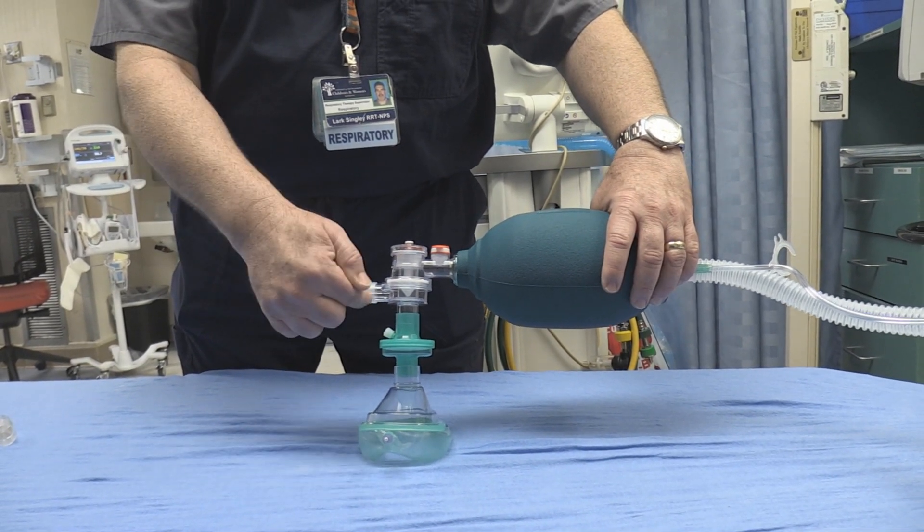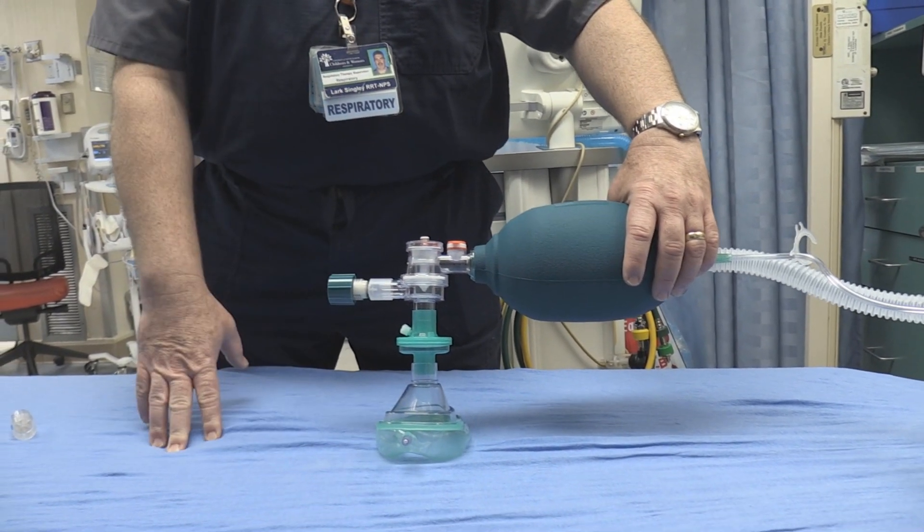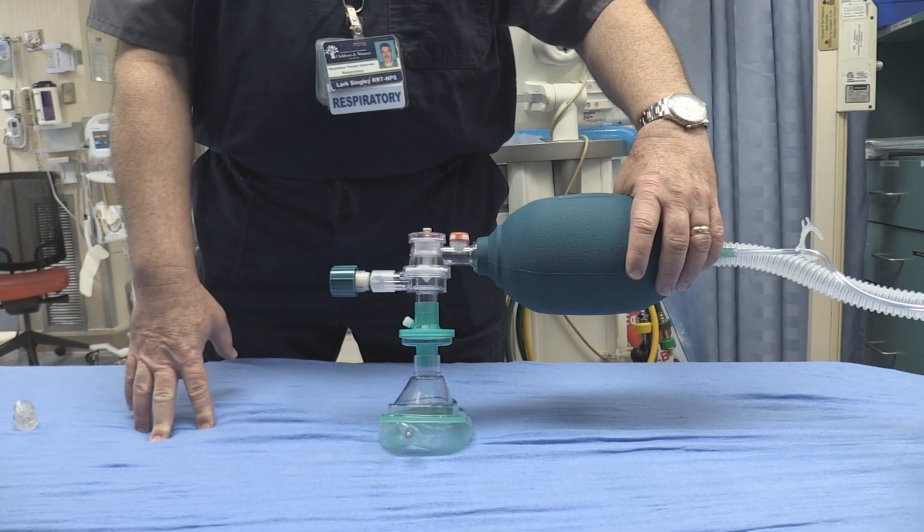Now if we moved the filter to the exhalation side, you would just be filtering what's being expired from the patient.